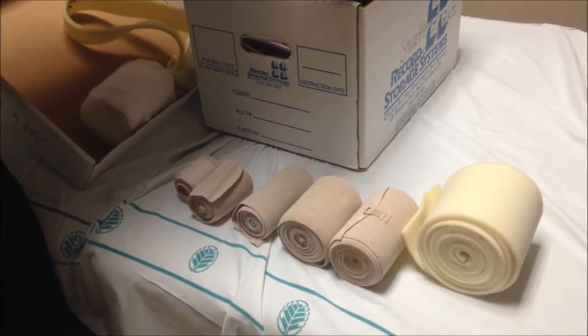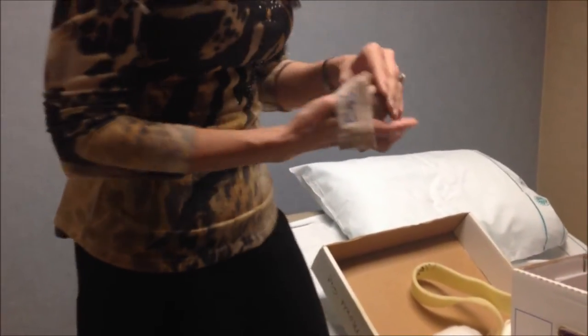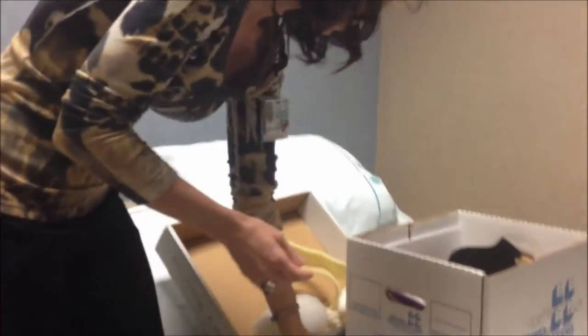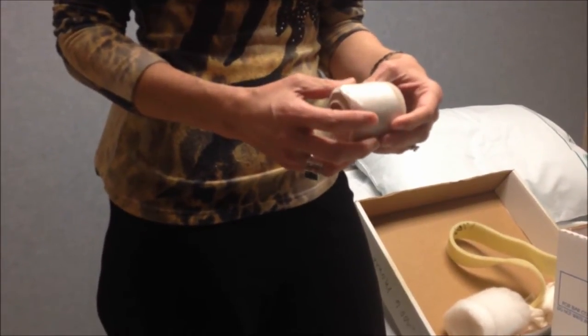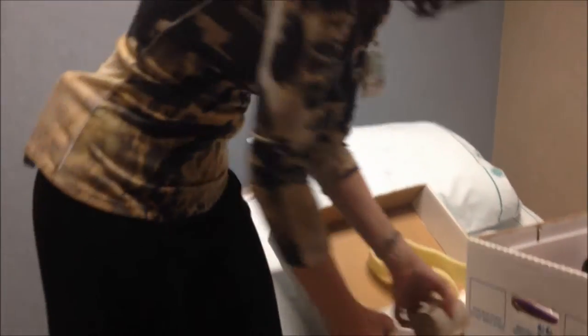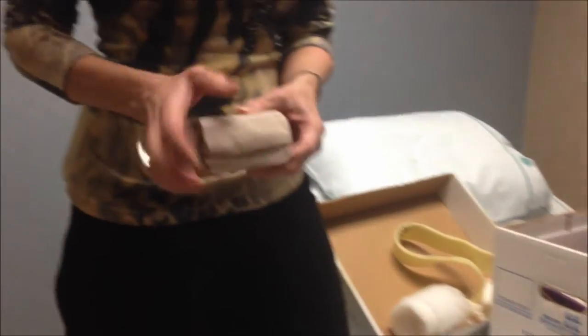Rarely do I ever use the little one except for babies — we do wrap babies, so that's my baby wrap. This is a six centimeter; we tend to use this on the hand, especially with females. If you were wrapping a male you might use a six or an eight because they tend to have much larger hands.